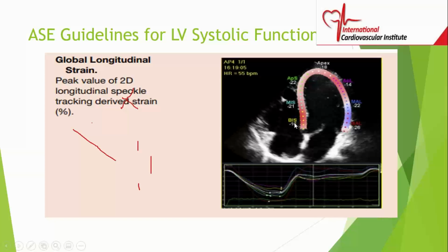As mentioned before, strain has become very, very popular, and we use it quite a bit. We'll go over what strain is, but basically strain is just a change in the length. We use the Lagrangian strain.